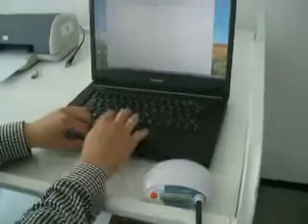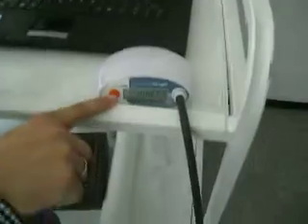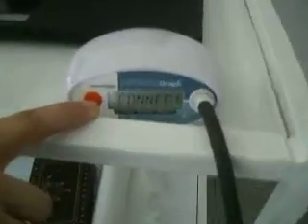To start the measurement, you don't have to do anything else than press the start button, and after that you will get a confirmation window just as a reminder of what the suggested cuff type was. Just press yes. Now you can see that the device and the computer are communicating, and this is how the measurement starts.